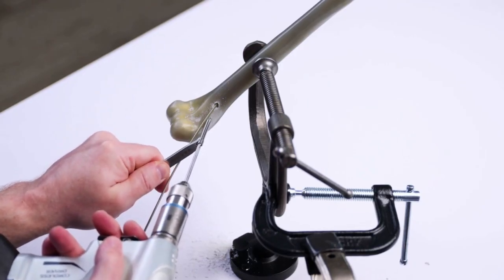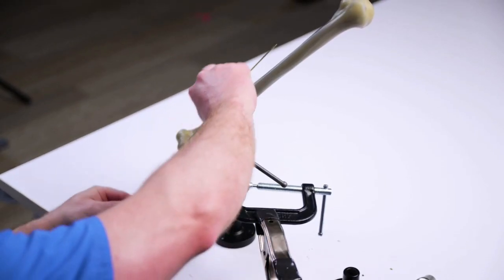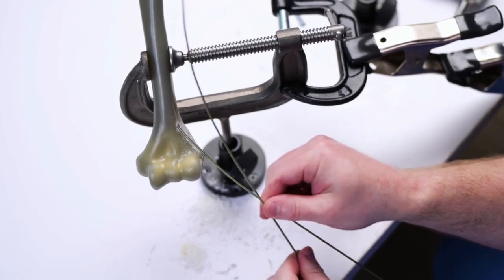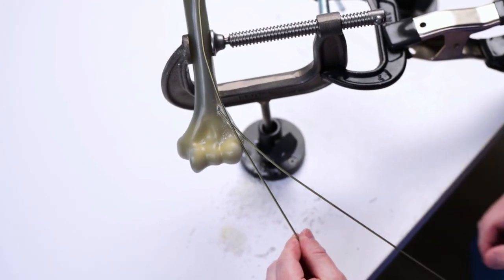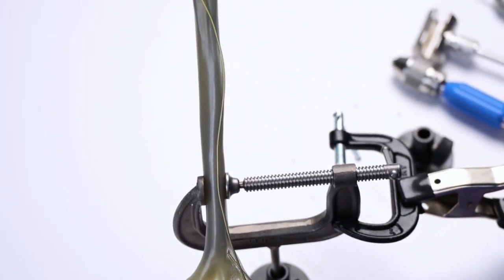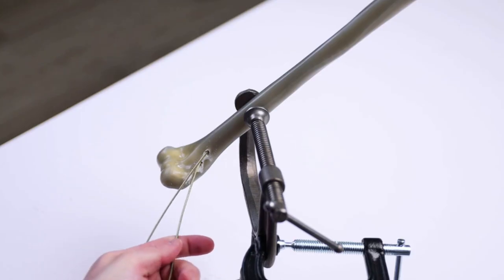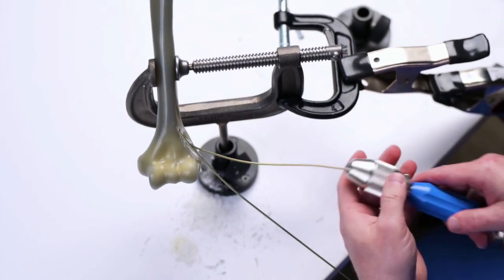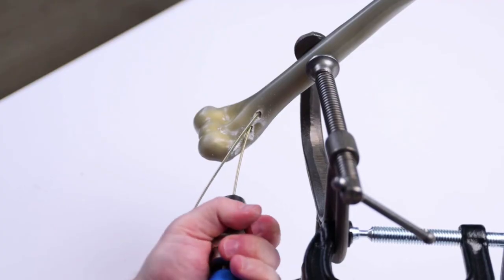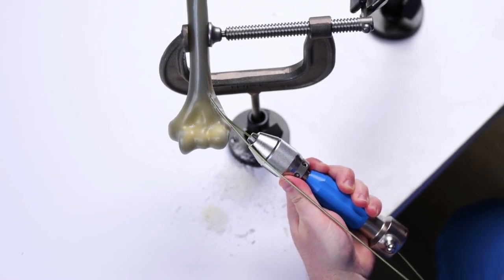The second entry point is created just distal and posterior to the first. An S-shaped flex nail is templated and bent. The S-shaped flex nail is first placed backwards and passed through the lateral column into the intramedullary canal, taking care not to violate the medial cortex.